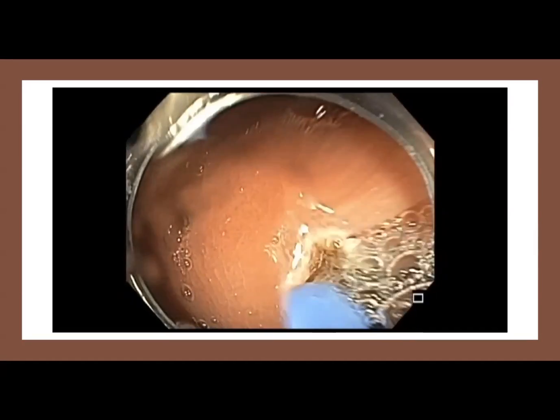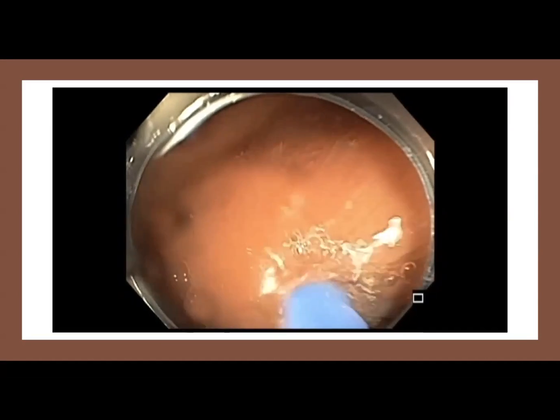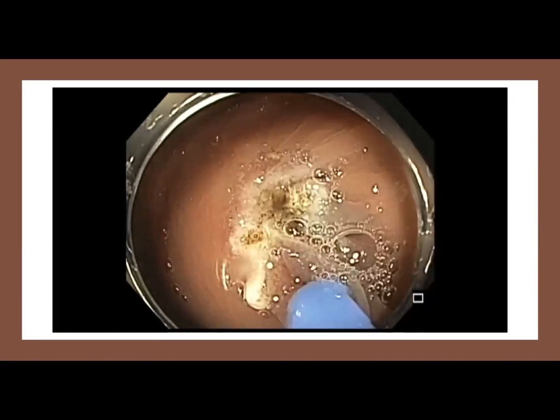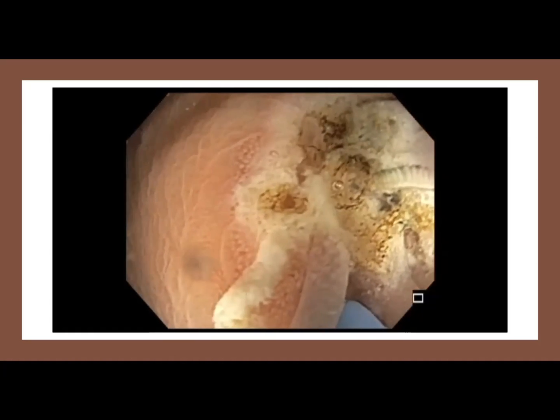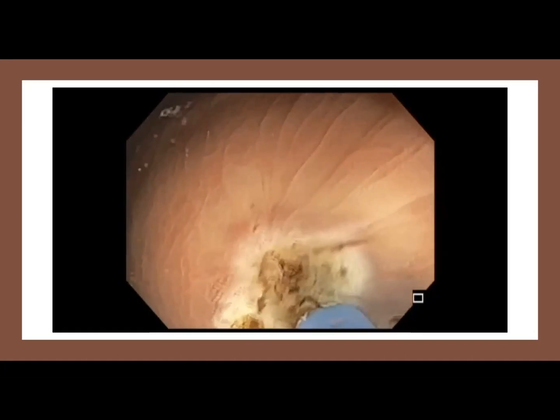Without submucosal injection of saline in the cecum, when you apply APC, there is a possibility that the thermal injury could get deep and include injury to the muscle. So that is one thing to keep in mind.